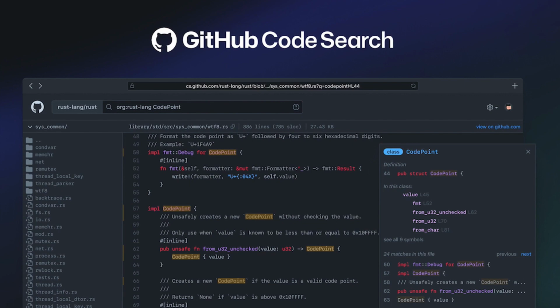And so now we're going to move on to how the code was engineered. The original code was an object recognition code taken from GitHub, a collaborative open source code hosting platform. The model consisted of 2 parts, a feature extractor and a regression head. An EfficientNet B7 model was chosen as the feature extractor because it's small in size, yet the accuracy is very high. The small size allows it to be easily deployed in small compute environments and can do predictions faster than other models of larger sizes. Thus, it represents the best of both worlds, speed and accuracy.